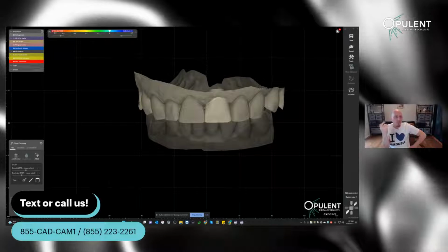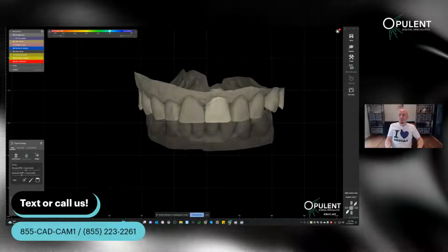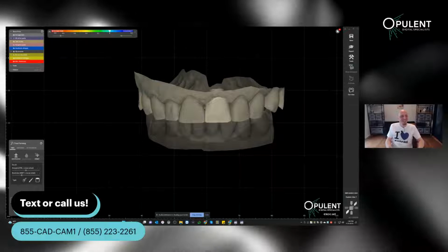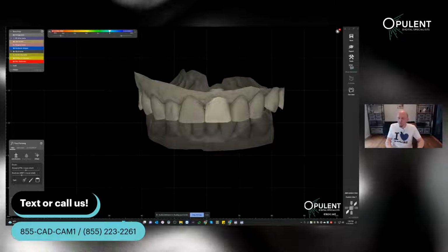So we all love Exocad here. I'm not making a secret out of it. Exocad's awesome. They also make good T-shirts. Thank you, Larry. Exocad's amazing, and that's what I learned and grew up on.